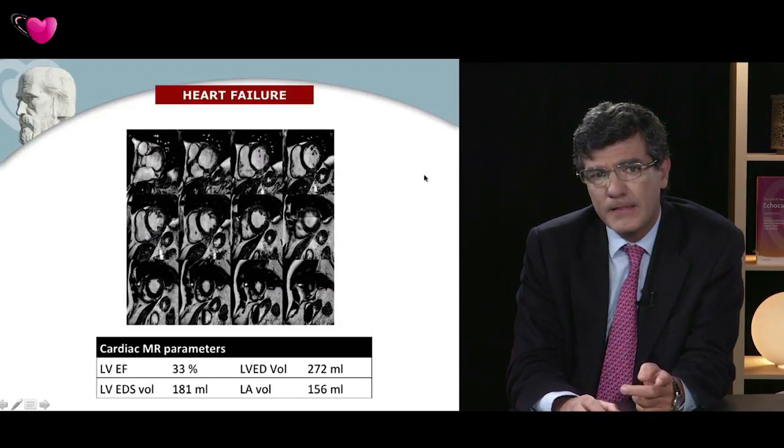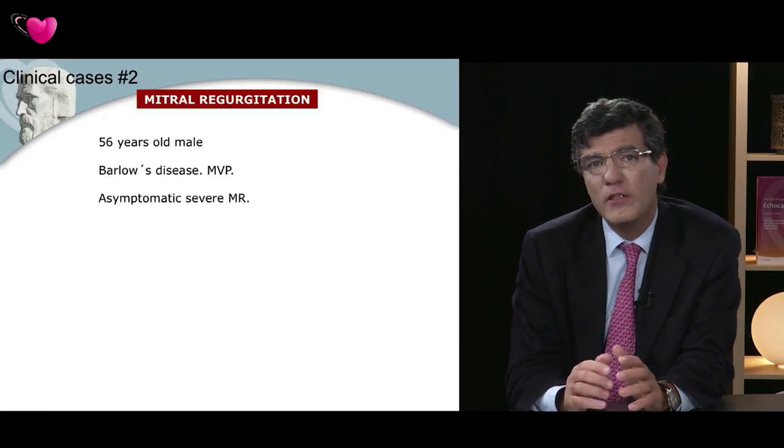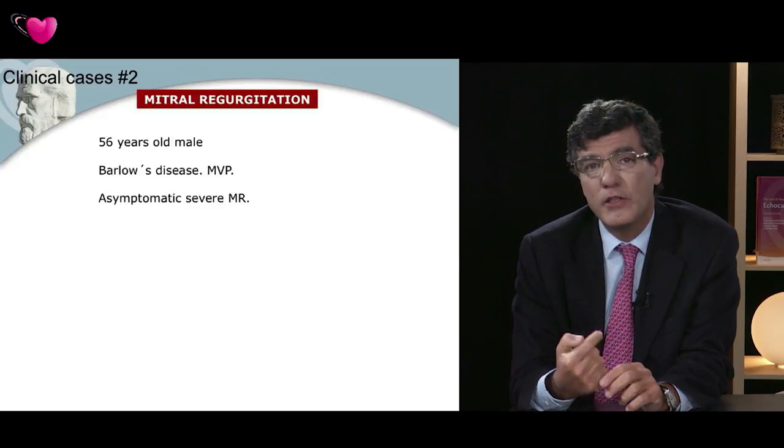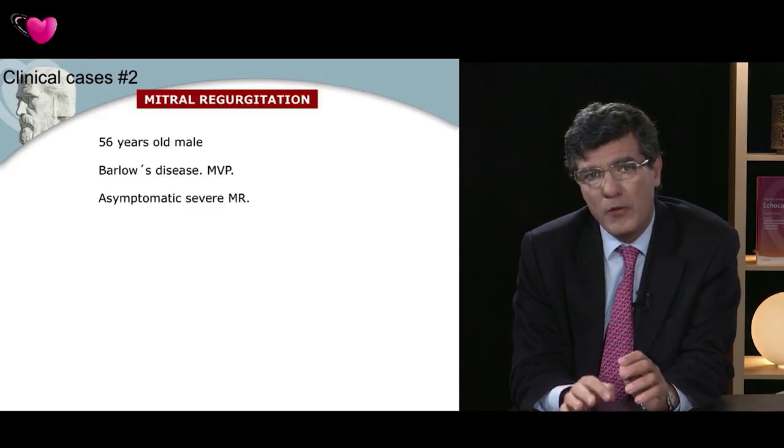Also, this is true for valvular patients. We take decisions in the guidelines according to the volumes. We take decisions according to the ejection fraction. So we really need to be accurate here.